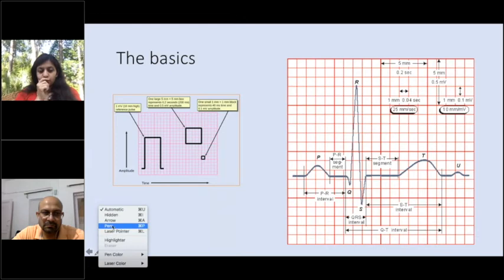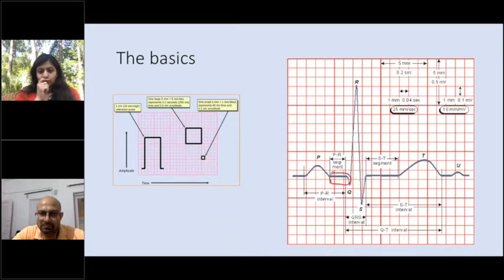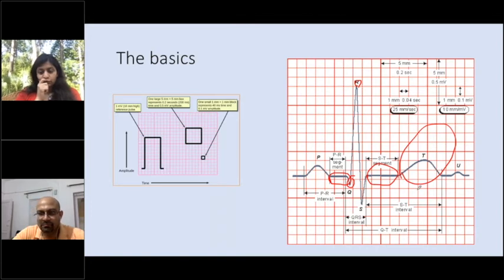The PR segment is from the end of P wave till the beginning of Q wave, the first negative deflection on ECG. We have R wave and QRS complex, which signifies ventricular depolarization. From the end of S wave till the beginning of T wave is the ST segment, followed by T wave. T wave signifies ventricular repolarization.